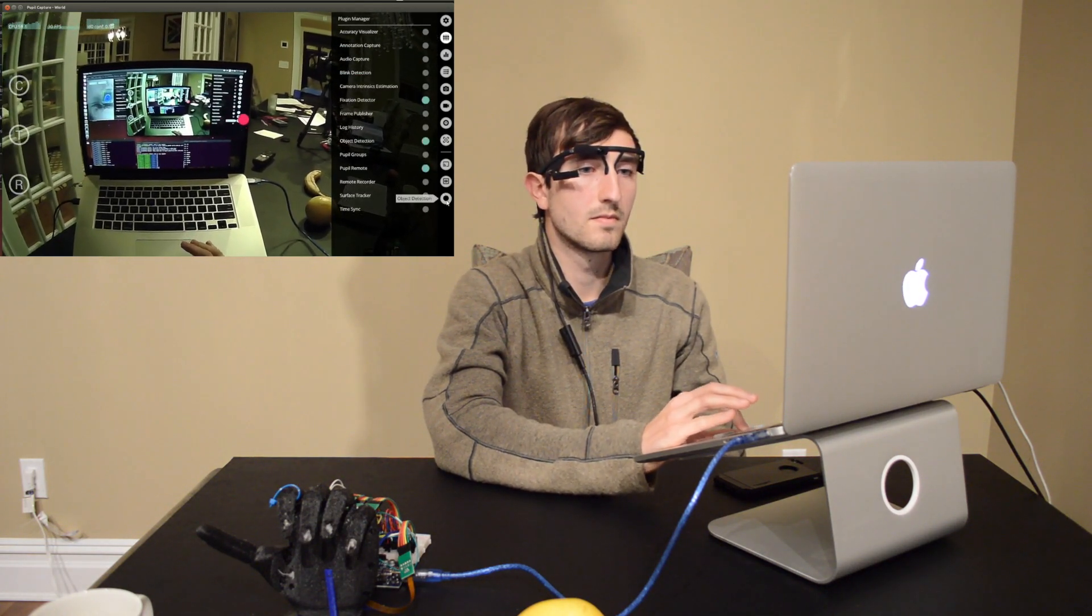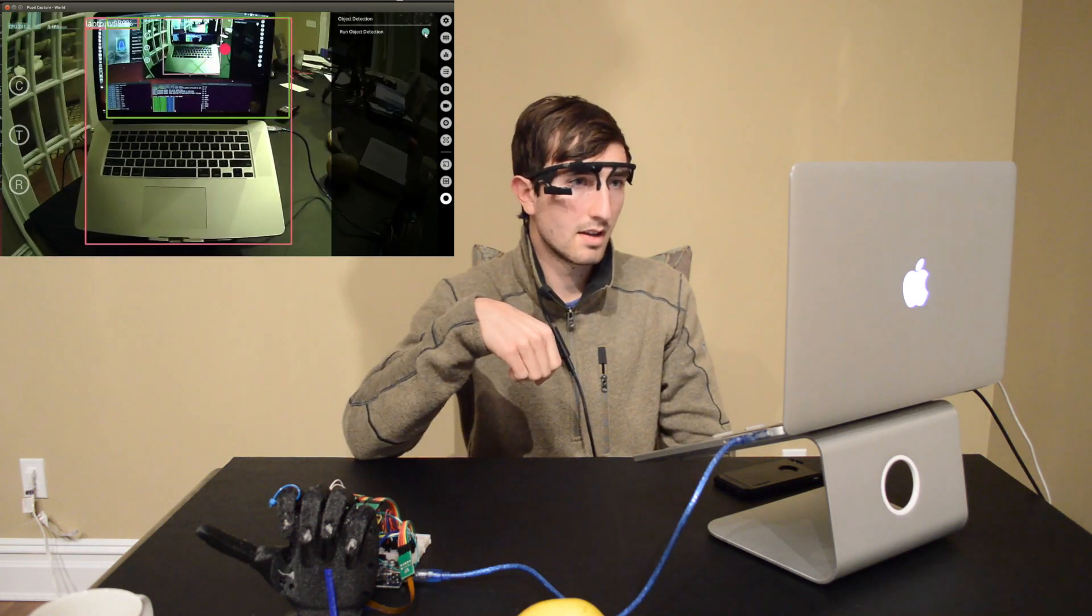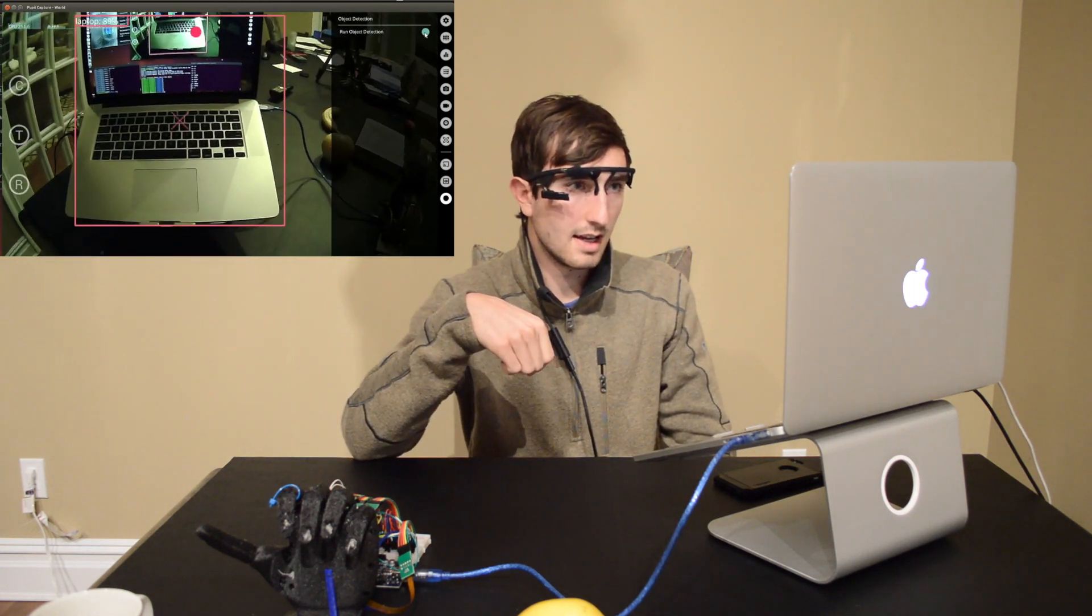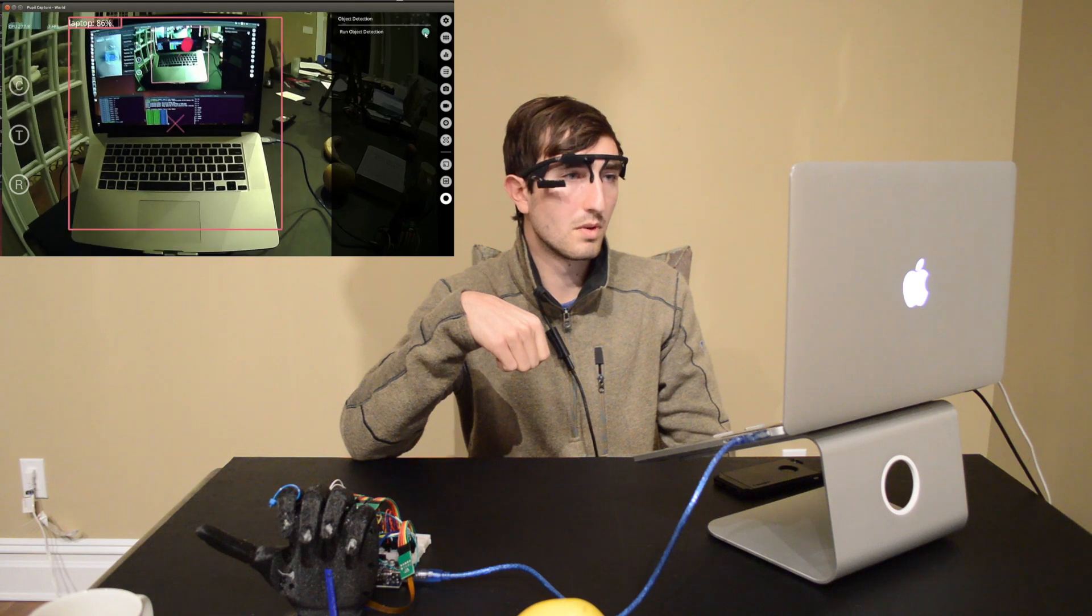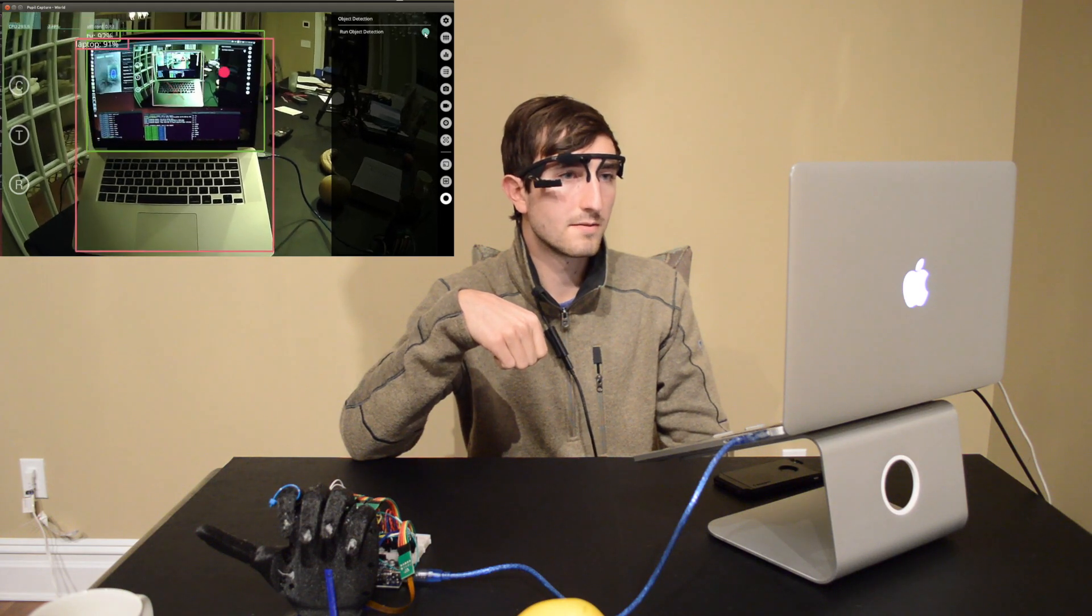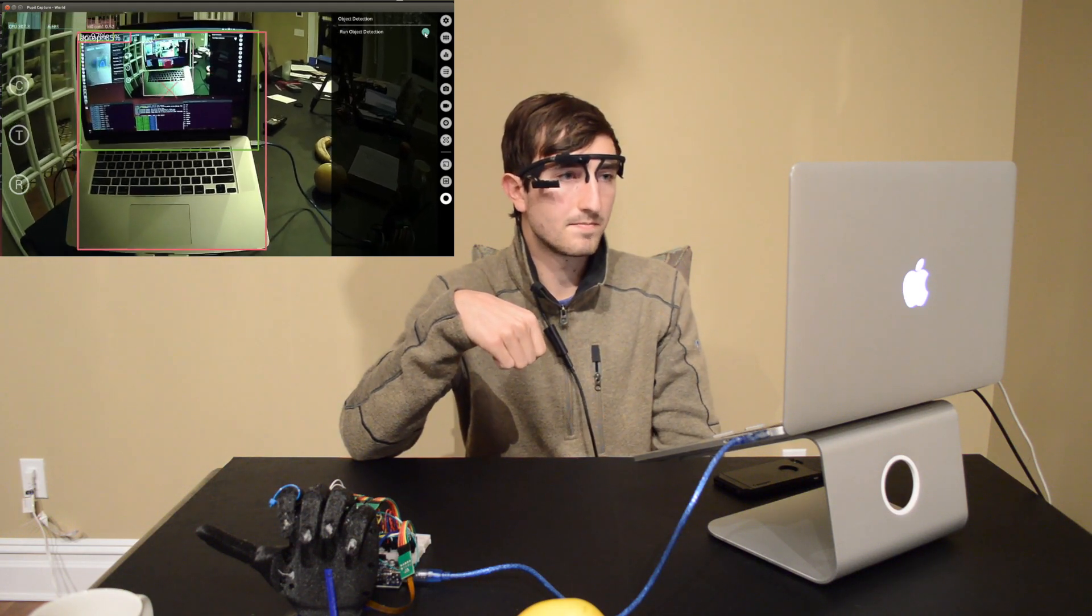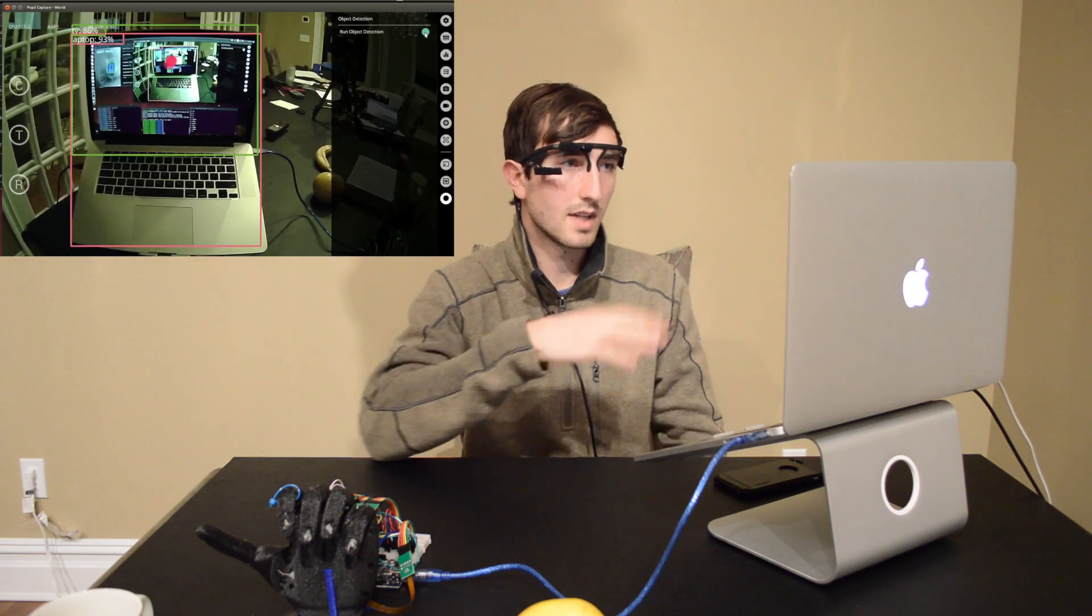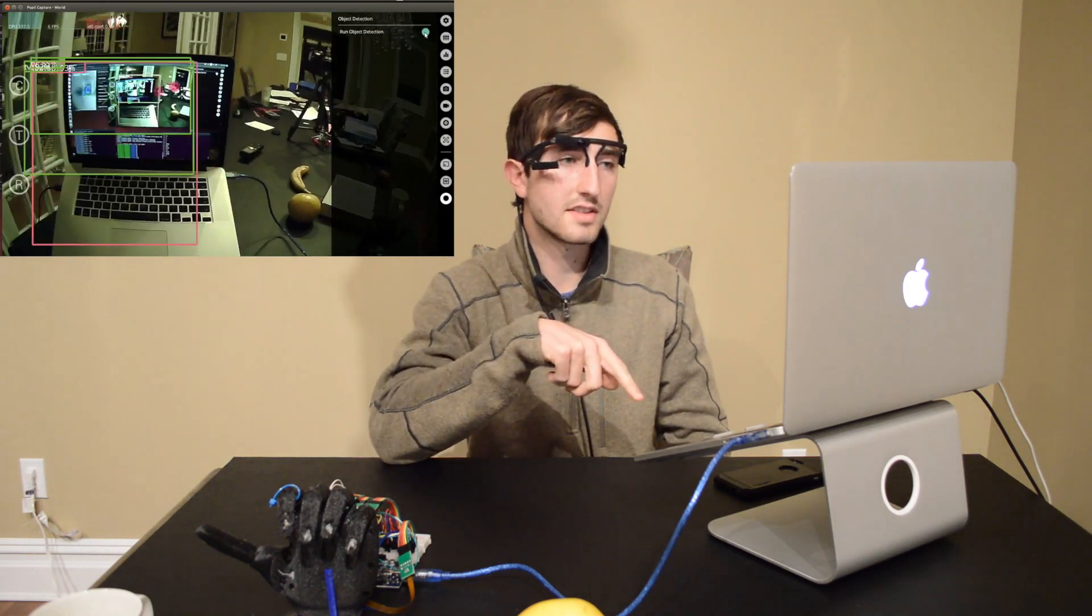And next what I'll do is run my object detection plugin, which will draw bounding boxes about the objects that are perceived in the world frame. And what we'll see here are obviously my laptop, TV, and the X is drawn at the center of the object which is closest to my current fixation.